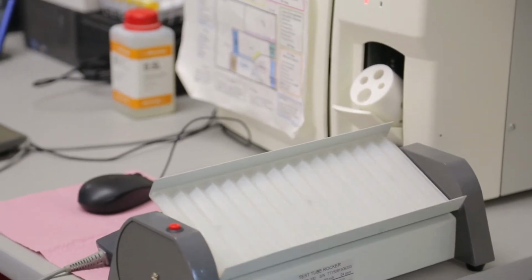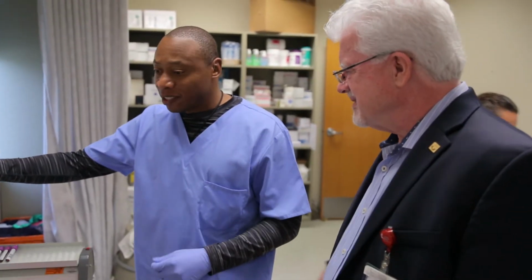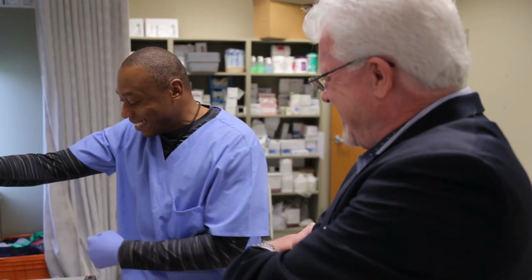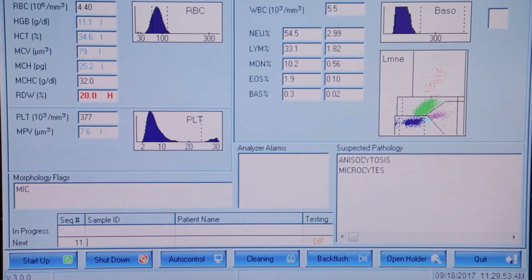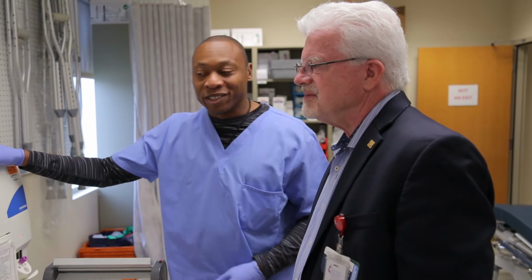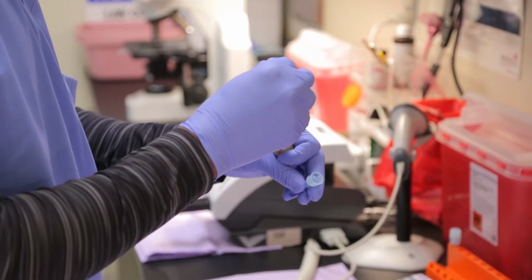And our smaller instrument here, this is our hematology analyzer. Since we don't do manual differentials right here, that hasn't changed a whole lot. Oh, no, not a whole lot. I could use one of those. Really? It'll also give you a histogram showing the differentials in your cell population, so you don't actually have to get under the microscope and do a manual diff. It gives it all to you in real time right there. But yeah, this is our lab and we're proud of it.